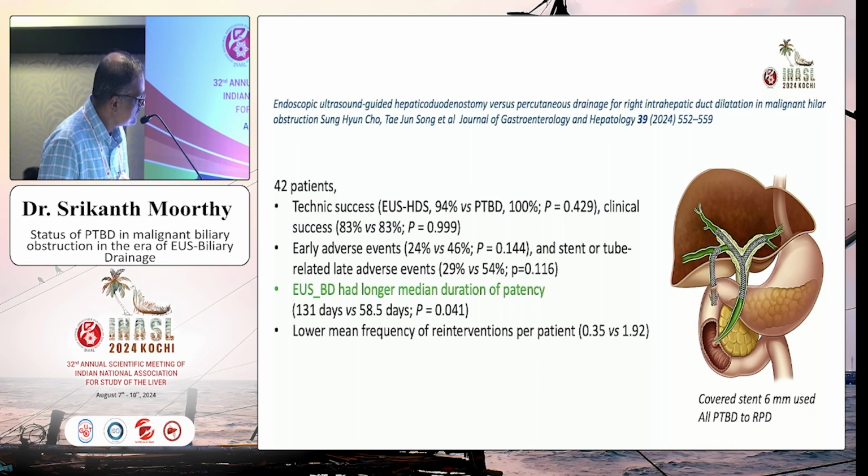But what was statistically significant was that the median duration of patency of the stent was higher for EUS BD. Now, I want you to note this. These are some of the issues here. They used covered stents, 6 mm for all patients. And basically, if you were to put the stent like this towards the duodenal bulb into the BD, you can see if it's a covered stent, it will block this duct and produce cholangitis. So you need this portion of the stent to be open. So these are things that are still evolving. Another problem with using covered stents is that covered stents tend to slip out much easier than bare stents. So these sort of issues still need to be tackled.